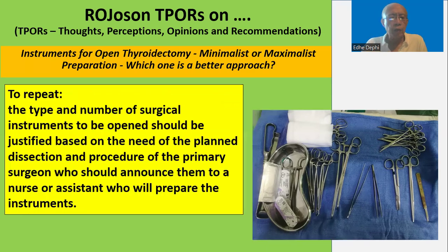To repeat, the type and number of surgical instruments to be opened should be justified based on the need of the planned dissection and procedure of the primary surgeon, who should announce them to a nurse or assistant who will prepare the instruments.